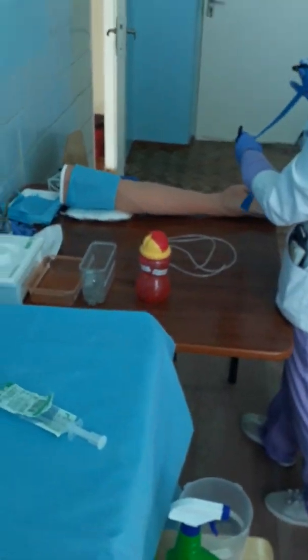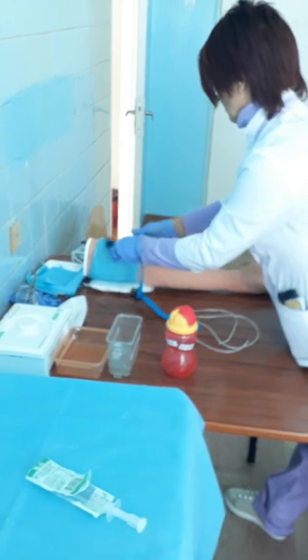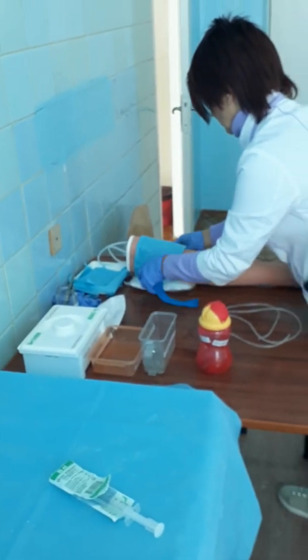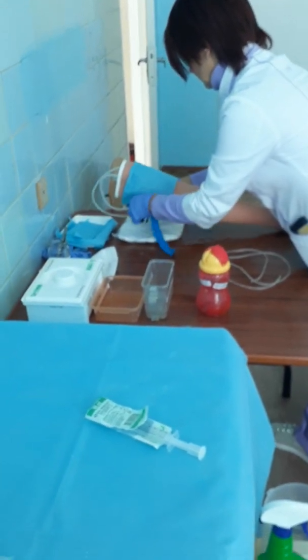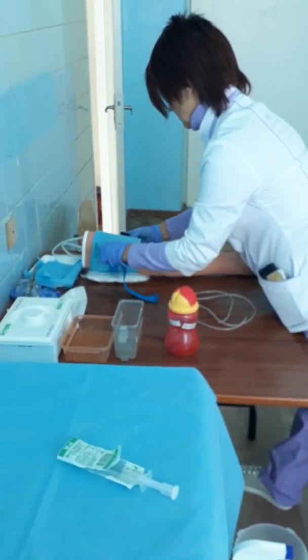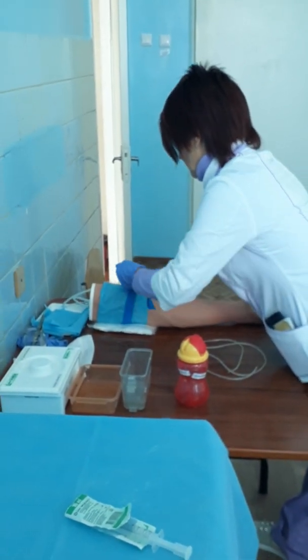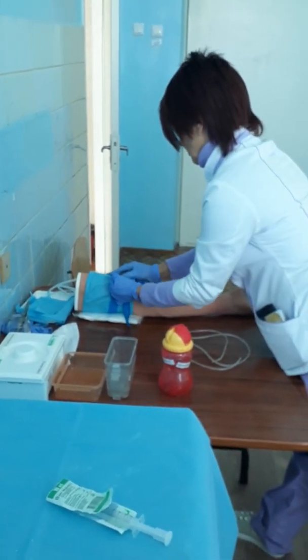When it's a tourniquet for venous, you place this tourniquet in the right place. Press it.